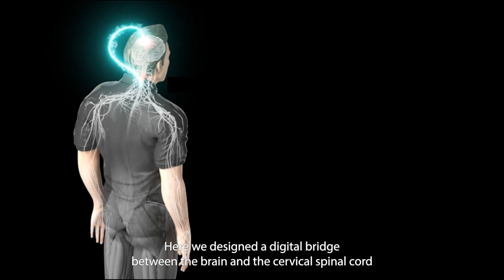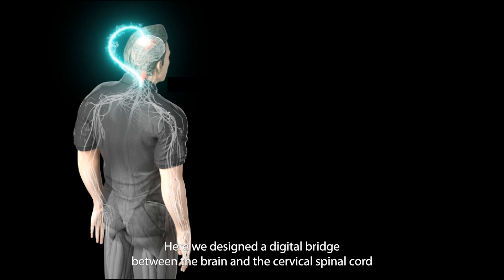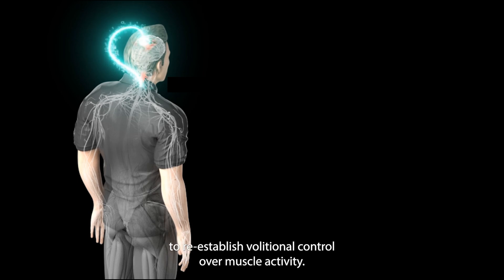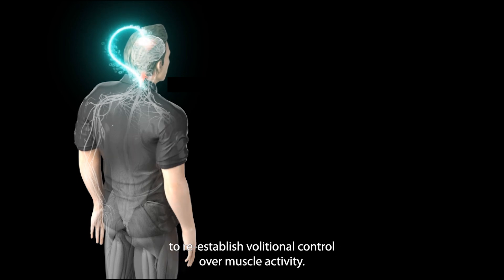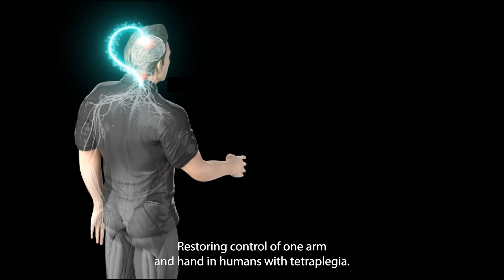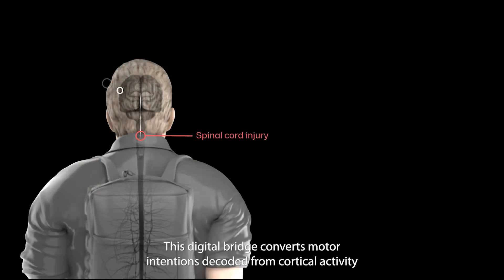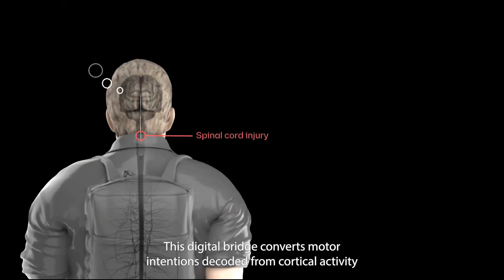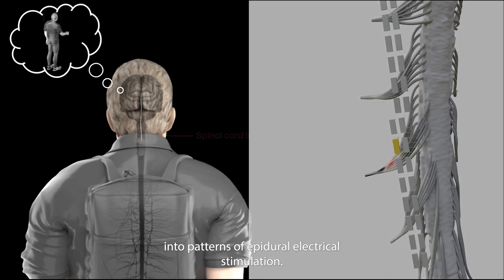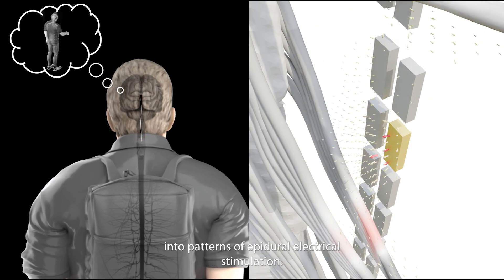Here, we designed a digital bridge between the brain and the cervical spinal cord to re-establish volitional control over muscle activity, restoring control of one arm and hand in humans with tetraplegia. This digital bridge converts motor intentions decoded from cortical activity into patterns of epidural electrical stimulation.